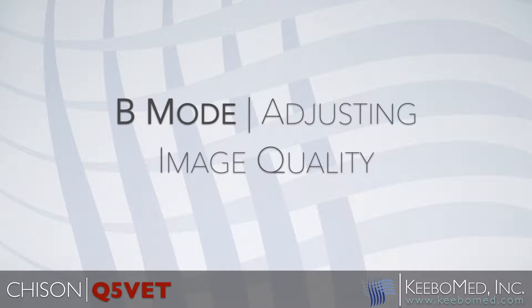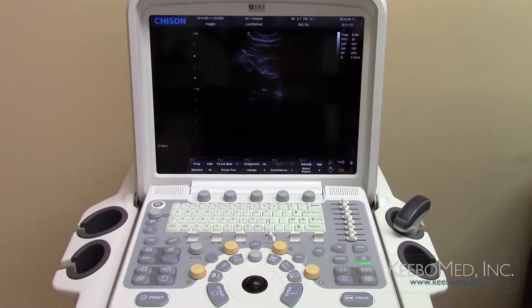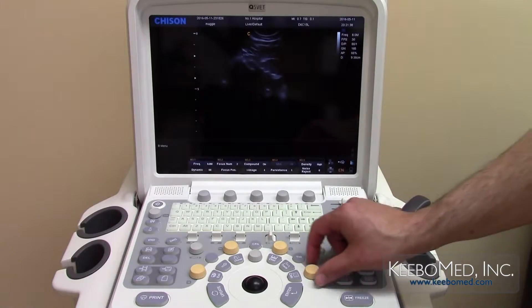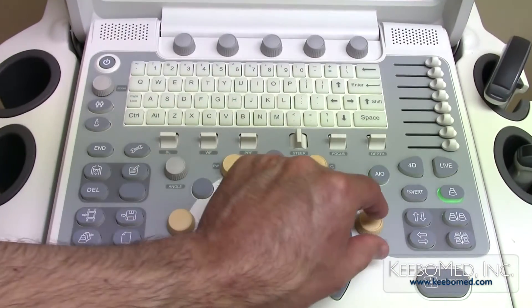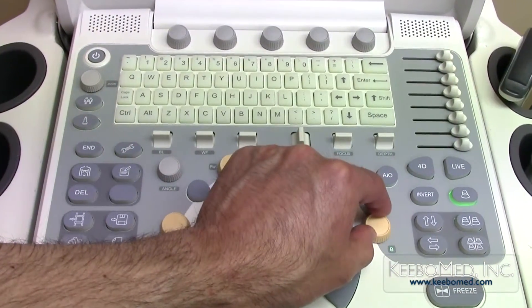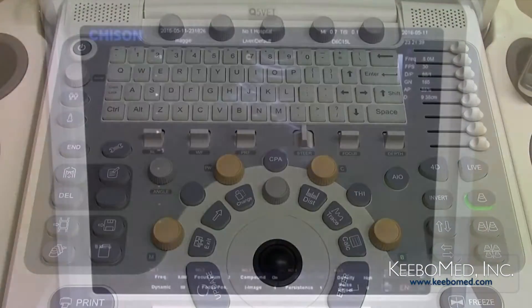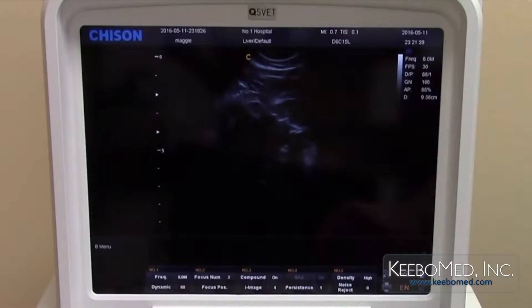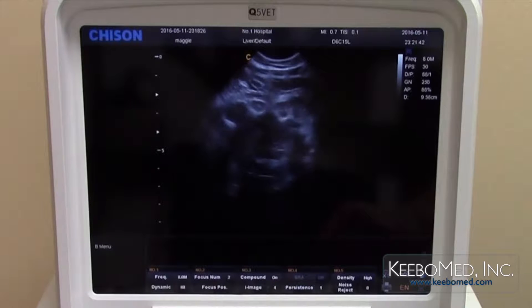There are five adjustable parameters using B mode. Number 1: to adjust the total gain of the image, turn the B mode button clockwise or counterclockwise. The contrast of the image will become brighter or darker.